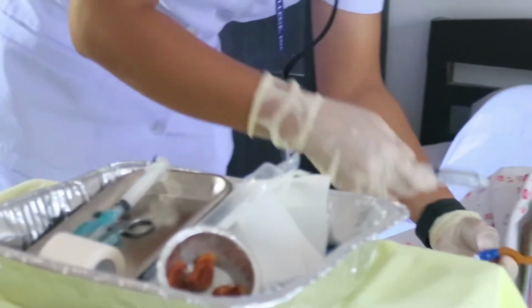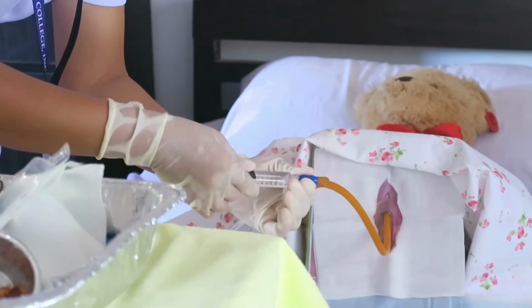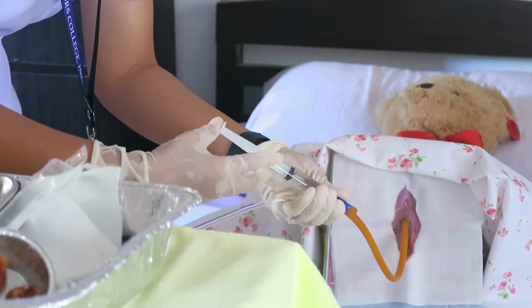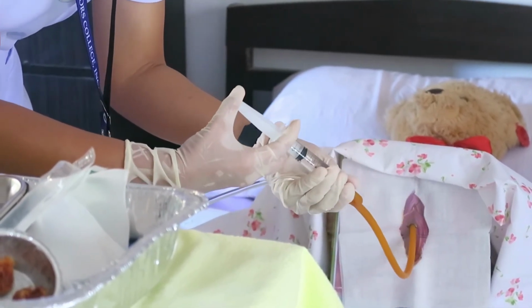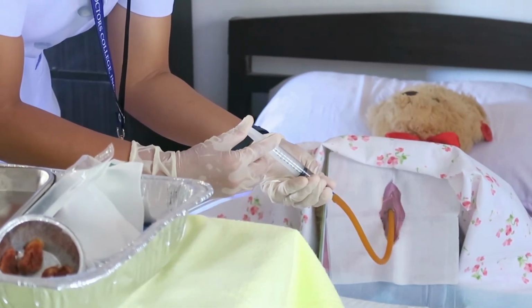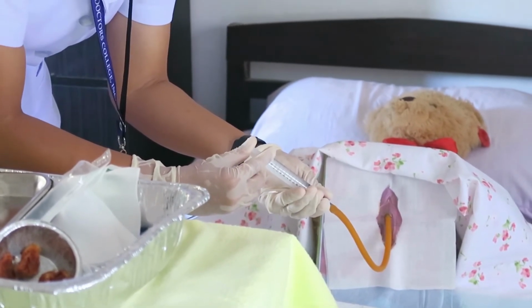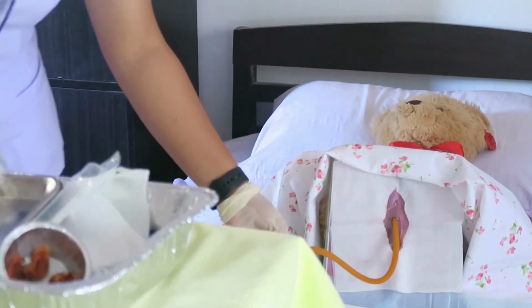Then inject to the catheter. Then discard.